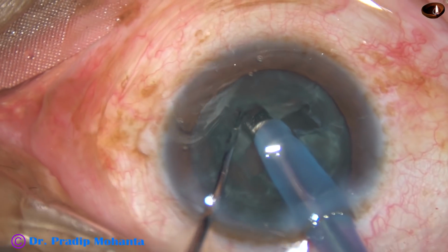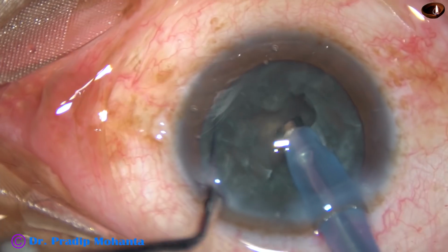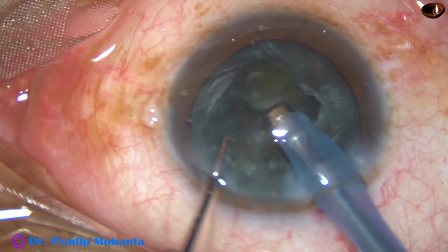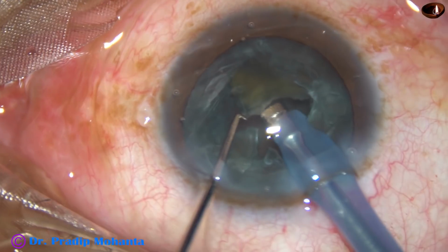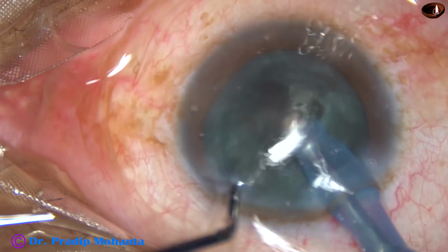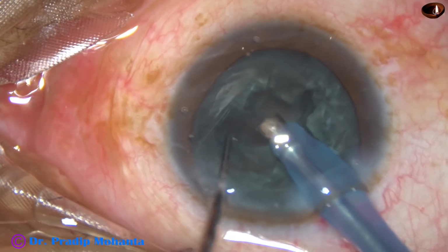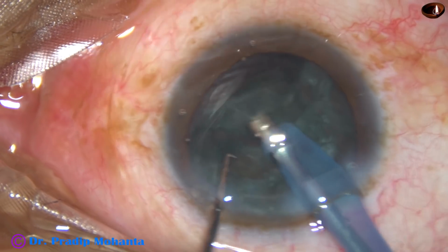Red glow is showing, so go to the floor and give opposing forces, and it divides so nicely. Rotate the nucleus in such a way that the chopper doesn't cause any damage to the lens matter. And now go to phaco 2 mode and emulsify this free nuclear fragment. Yes, now again rotate and go to the floor of the groove and apply opposing forces, and you can crack this soft cataract.